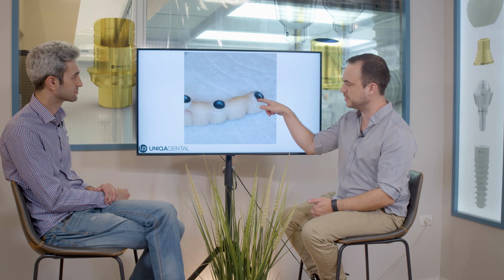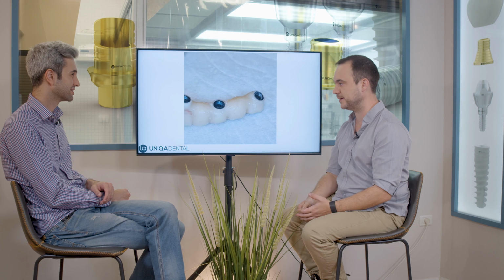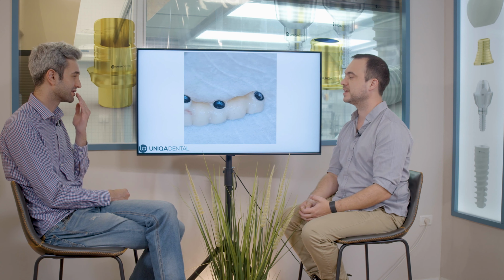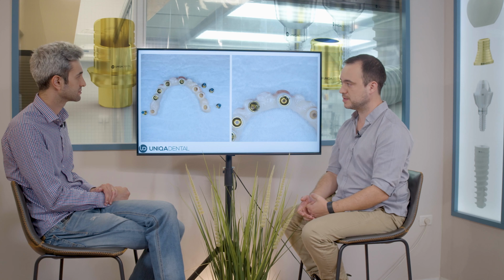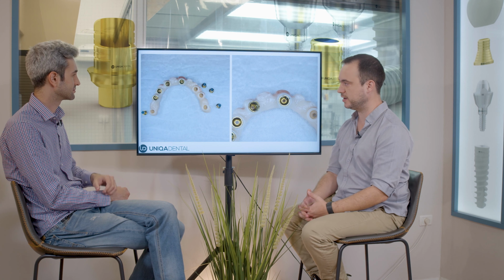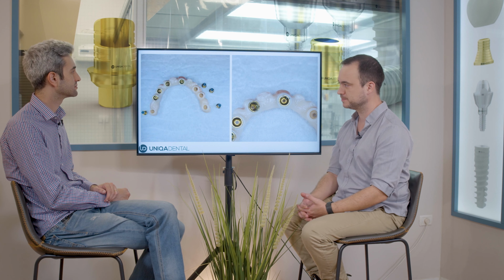Later on we'll close a little bit the gap. You can see most of the deviation is on the posterior sleeves, because if you have any inaccuracies in the center, the posterior sleeves are affected the most. This is why we screwed the anterior in the first place, to see the deviation. Exactly. The last bridge was the lower one. Now we can see that we have the same with the upper bridge.